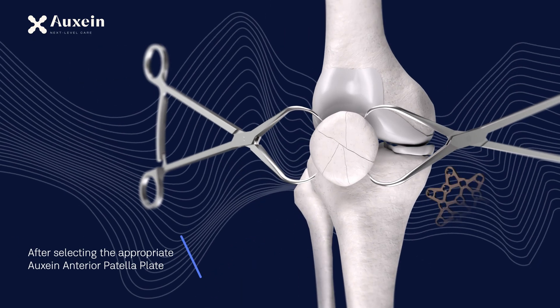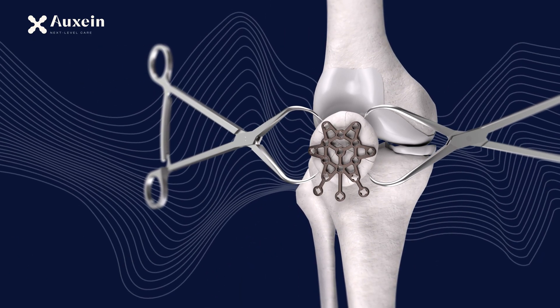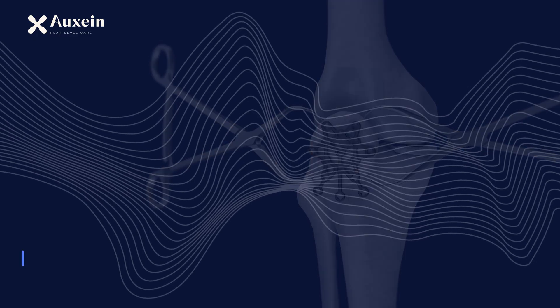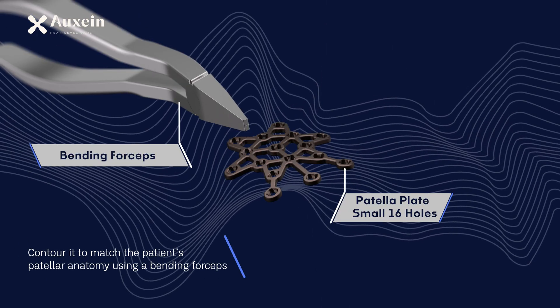After selecting the appropriate Auxein anterior patella plate, contour it to match the patient's patellar anatomy using a bending forceps.